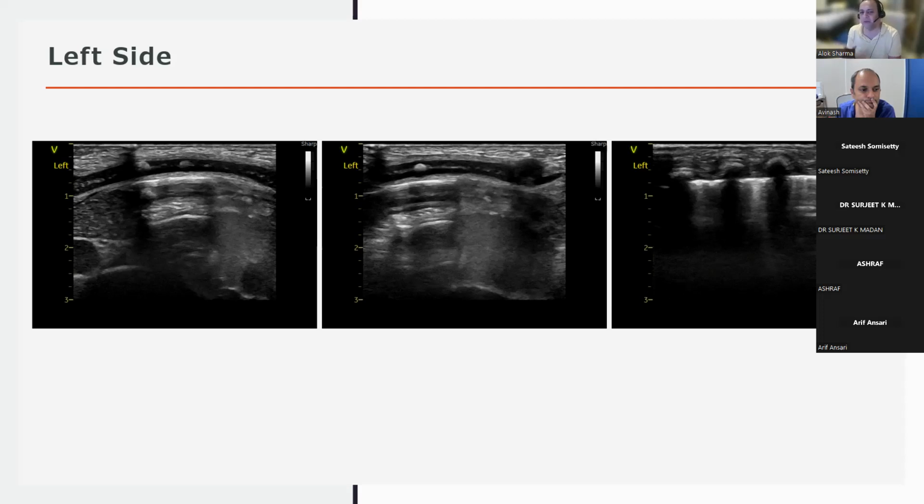Now, if this is a baby that's getting worse, where I see widespread atelectasis, that's lung that can be recruited. But naturally, I would also know that the posterior parts of the lung in a supine baby are difficult to recruit. So if I'm increasing pressures and looking to see that the pleura gets established and I recruit that lung, I would also be cautious because there might be normal anterior parts of the lung that get over distended and you can pop. So what is very important is that you take into account that the baby is supine and that you haven't been able to move the baby.